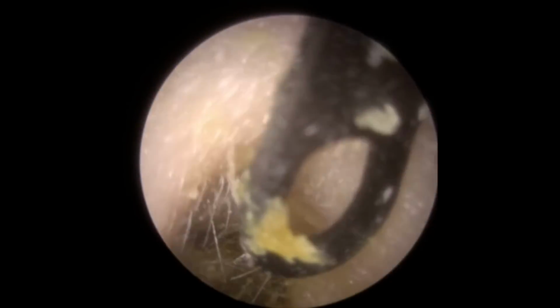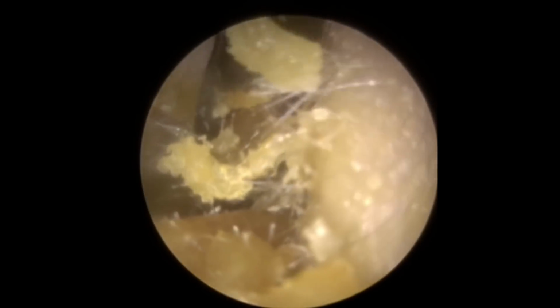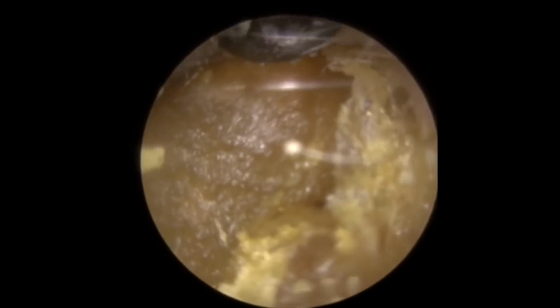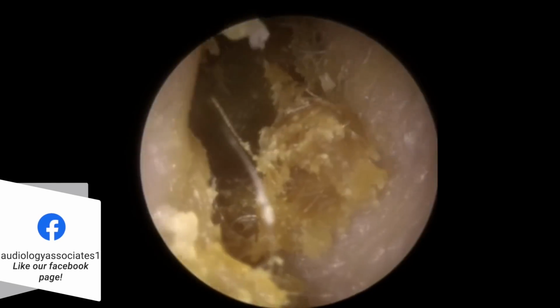It's got a very hard edge to it, so quite a hard outer shell, but the inner side is very thick, sticky stuff. There you go. We've managed to get into the gap there and pull forwards, but as you can see, it's just more folding the wax over on itself rather than actually bringing it out of the canal. So I'm trying to push into it and pull down at the same time, which is then going to pull the wax away from the top of the canal wall, but also to bring it out towards the front as well. Aiming for that gap again, there you go, see just pulling down slightly until I'm trying to fold this back section forward so I can get a good bit of leverage behind it.